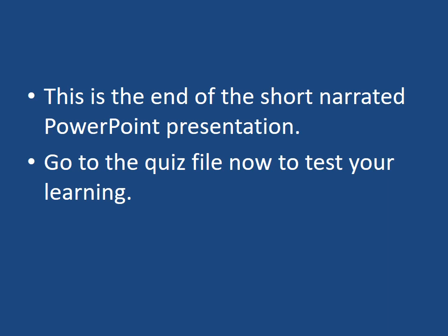This is the end of the short narrated PowerPoint presentation now. We've considered just a few different types of pathologies and looked at their appearances on a chest X-ray. What you can do next is go to the quiz file that has the same name as this but has the title quiz in there as well, and you can work your way through that to test your learning. Good luck with that.